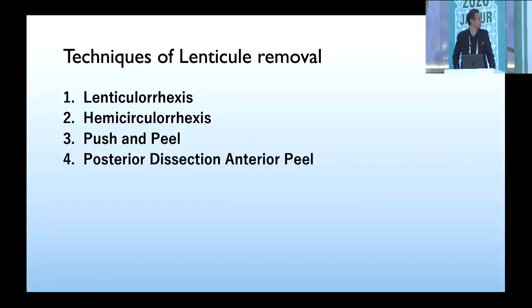The techniques of lenticule removal are lenticulorhexis, hemicirculorhexis, push and peel, and posterior dissection anterior peel.